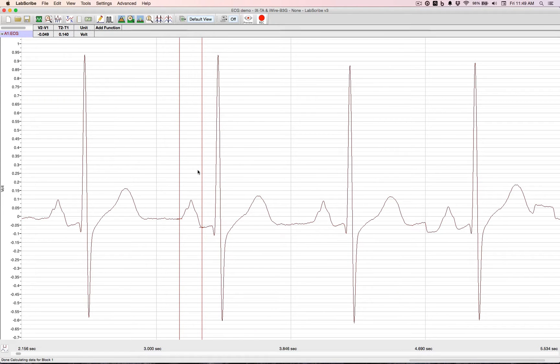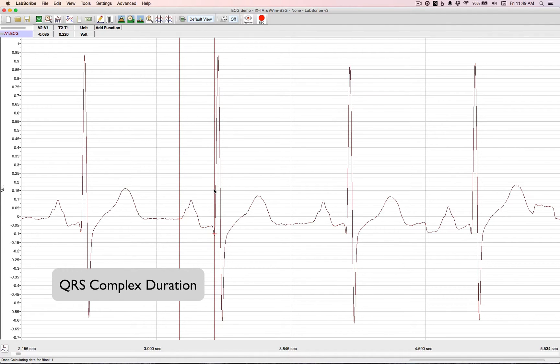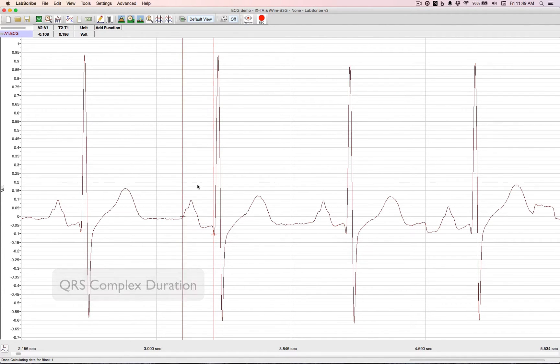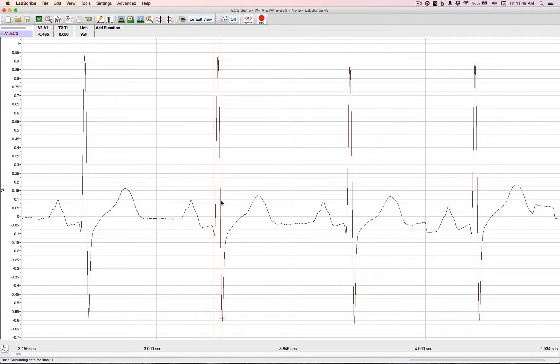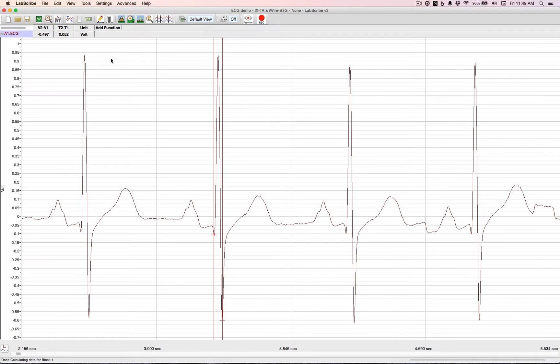To do a QRS complex duration, move one cursor to the Q. The other one to the S. That's 52 milliseconds.